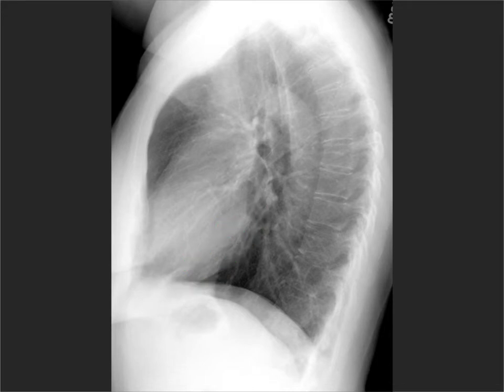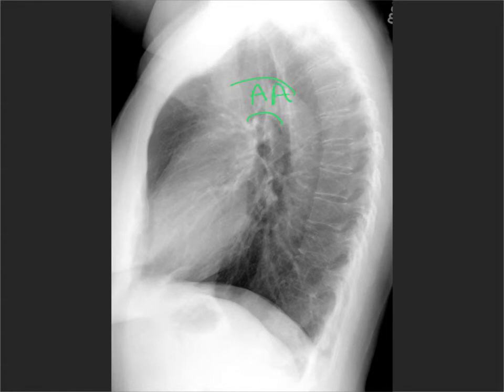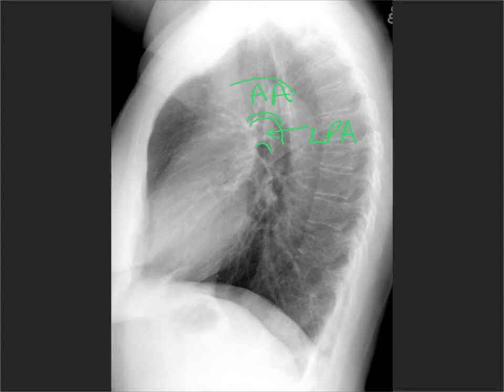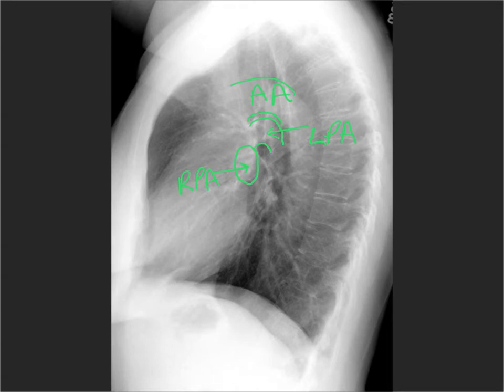Now let's look at the pulmonary arteries. The left pulmonary artery forms what I think of as a mini-aortic arch under the aortic arch. Find your aortic arch, look under it, and you'll see a structure which forms another little baby aortic arch — that is the left pulmonary artery. The aorta is on the left, and the left pulmonary artery is on the left, so look under the aorta. If you go anterior and inferiorly from the left pulmonary artery, in some patients you'll see an oval opacity that is the right pulmonary artery. Remember the right hilum is always lower than the left in normal patients.